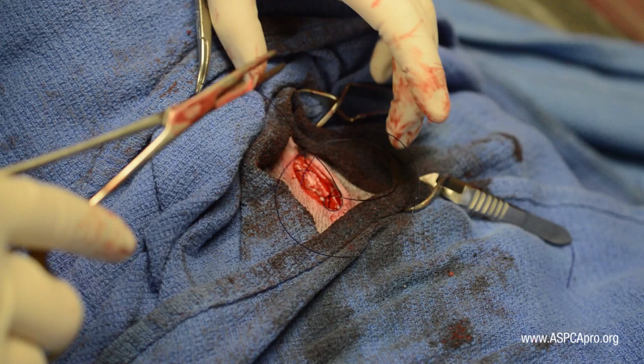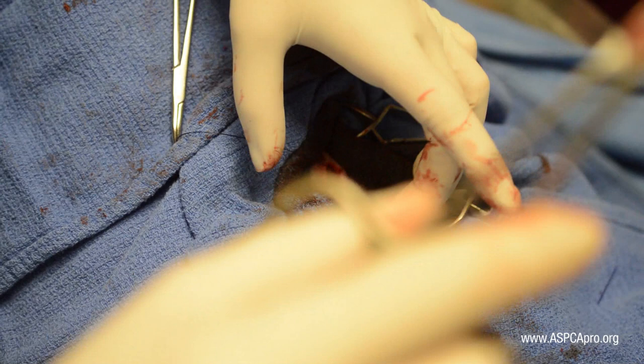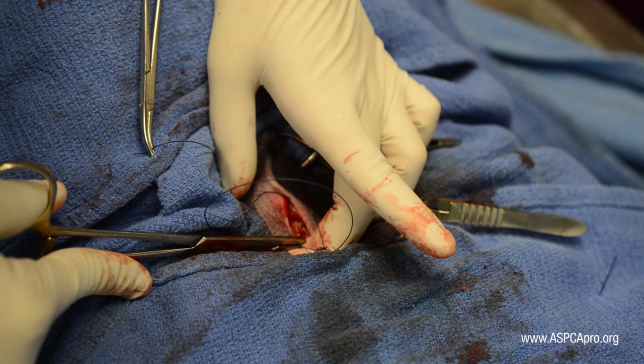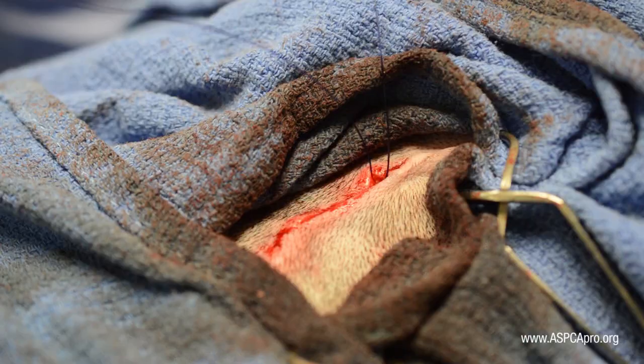To determine where to place the needle into the dermis during further bites, simply lay the suture across the incision. Where the suture lies is where to place the next bite. The next to last bite of dermis should not extend all the way to the end, so as to allow room to bury the end knot.